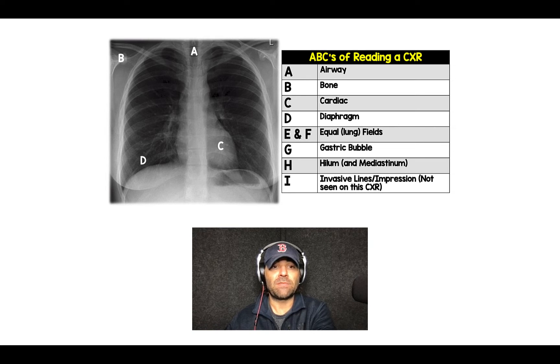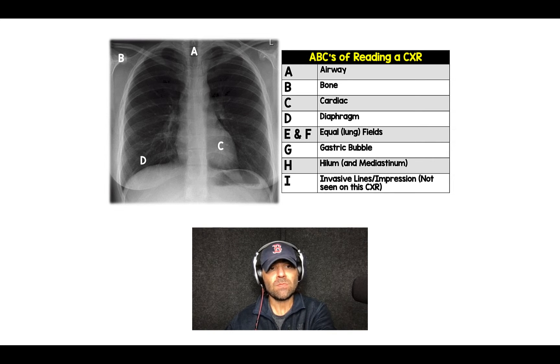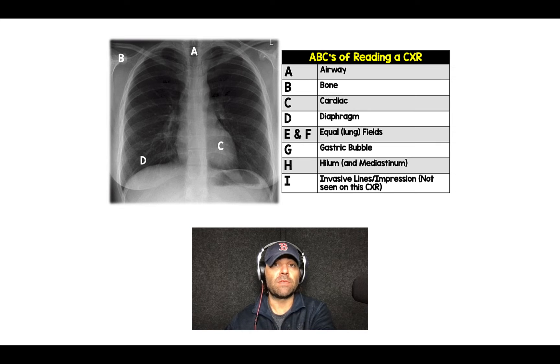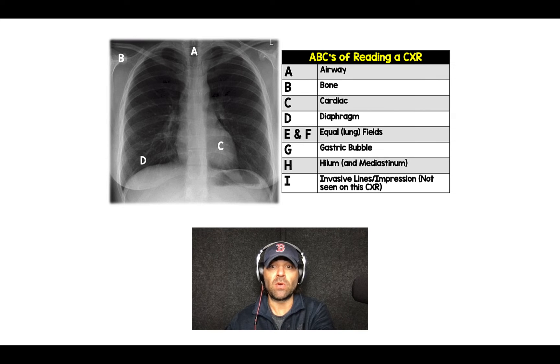D is for diaphragms. Typically the right hemidiaphragm is higher than the left hemidiaphragm because of the liver that sits underneath it. You want to make sure there's not a deep sulcus sign concerning for a pneumothorax, or air underneath the diaphragm, which is concerning for an abdominal perforation.